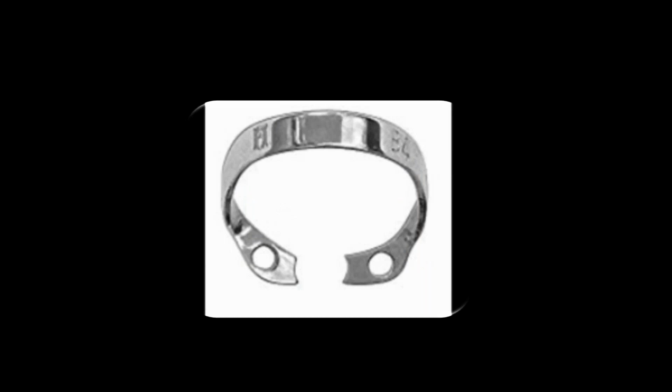This is the favorite clamp in the Brinker's clamp category, the B4. B4 clamps are excellent for tissue retraction for class 5 caries lesions in anteriors, canines, and premolars. But mind you, look at the clamp, it's so delicate. Look at the jaws, they're hardly there. The hole in the jaws is bigger than the actual jaw. So you can see it's absolutely light. So it always requires an additional retainer clamp, and only then can you actually perform a stable isolation. But the kind of atraumatic tissue isolation that it does cannot be compared with anything else.